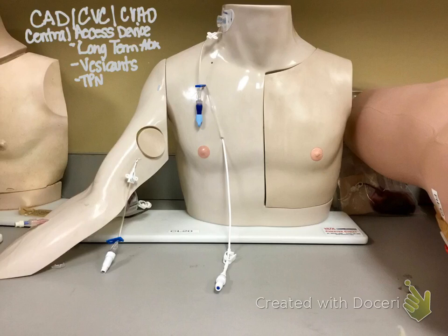TPN can sometimes be a vesicant as well. It can cause tissue damage. So anytime someone has central parenteral nutrition, they need to have a central line. So keep that in mind. Now, you may see there's also peripheral nutrition, which is less strong and has fewer additives, and can be given peripherally. But we're talking about total parenteral central nutrition, which can be hard on the vein, so you have to have a central line for that.